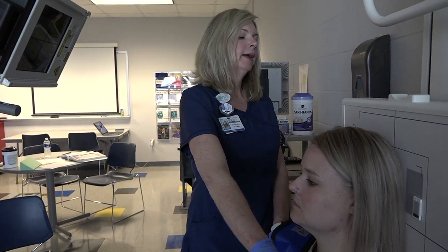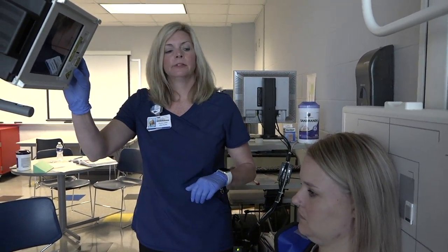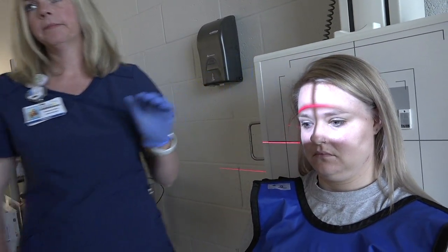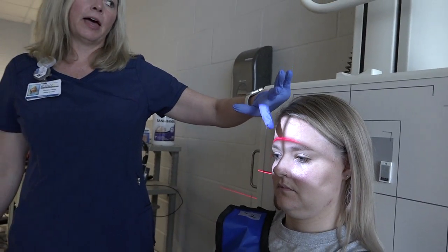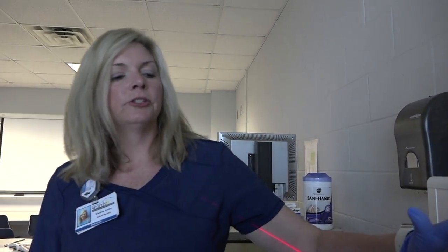This projection is the AP Axial Modified Towne. It's the same angle as the AP Axial Towne — 30 degrees caudad — but the central ray is different. Make sure the OML is perpendicular to the board and have the patient tuck their chin as much as possible. The centering point is one inch above the nasion, with the CR down the mid-sagittal plane and no rotation or tilt. The anatomy demonstrated will show the central ray going through the mid-arches to the level of the gonion.